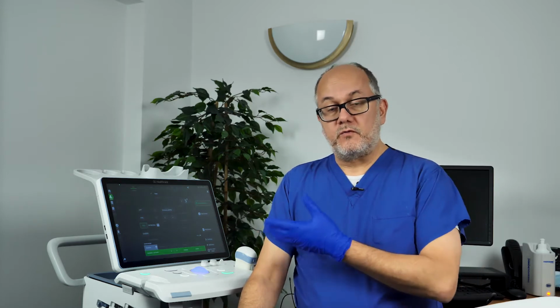The second thing is that it recognizes the quality of the images by assessing standard image-based criteria. So in the abdomen, for example, it will look that the stomach is visible, that the umbilical vein is a third of the way along inside the abdomen, that you have a nice circular abdomen, and so on and so forth. So not only is it looking at the completeness of the record, but it's also making sure that the images that you're acquiring are fit for purpose, and they're fit for purpose for your imaging record, but also in the case of sonographers, for the reporting radiologist. So let's see how the system works.